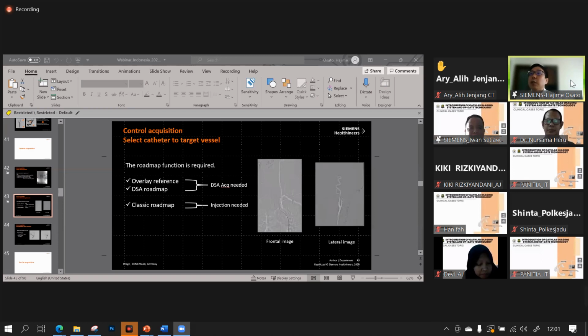Yes, thank you so much. CT's time resolution is better than Dyna CT. More or less, it takes 5 seconds in rotation time. So this is a weak point for our Angio 3D, because volume data is taken in 5 seconds.